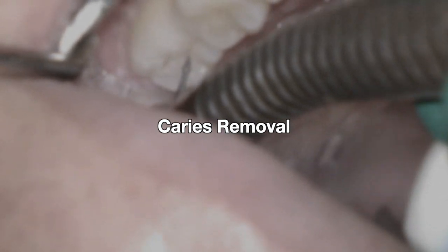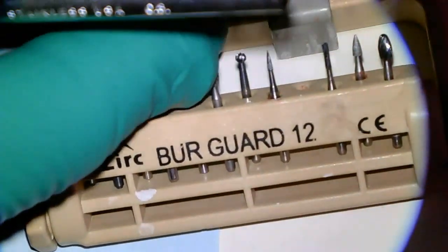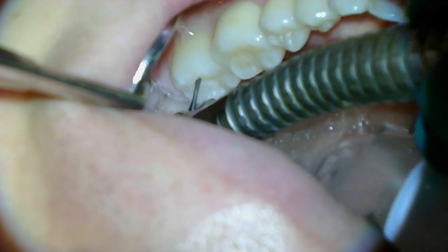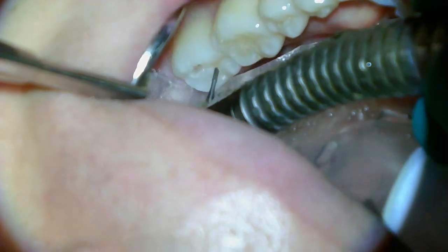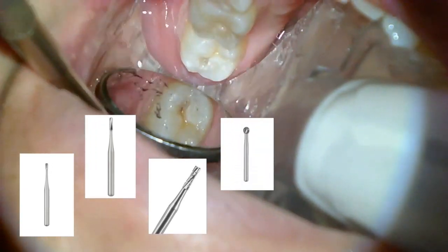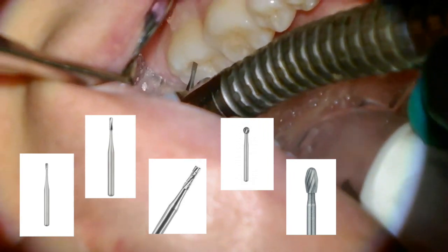Right away the doctor starts with the caries removal. In this video you will see a combination of using burs and the Solea laser. I'm not going to go over our bur kit because that can change depending on what your doctor likes to use. However, for a simple filling like this one there are some common burs you may need for any resin, such as a 330, a 245, maybe a 557 or a round carbide bur, and then to finish off the filling you may need a football carbide and some polishing cups.